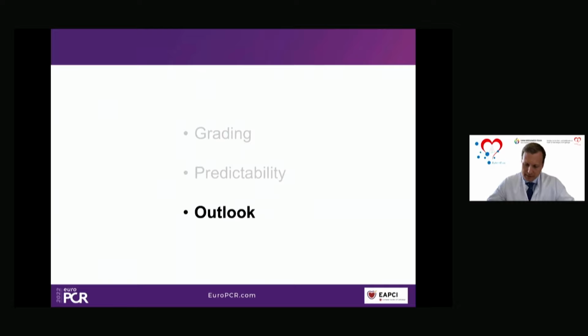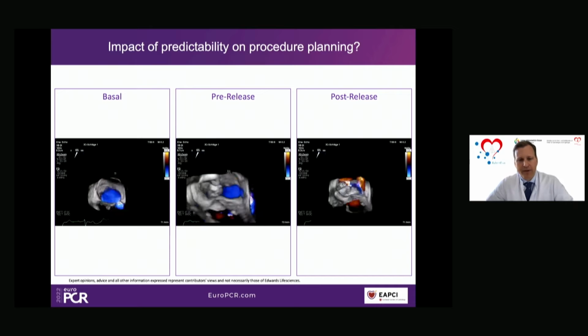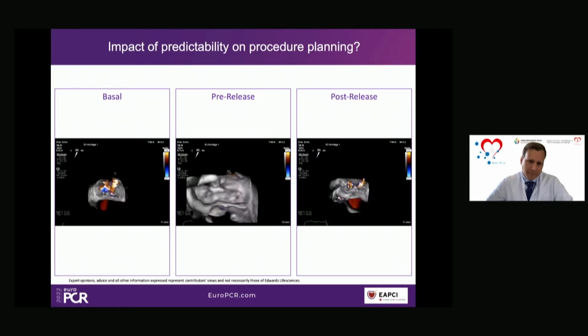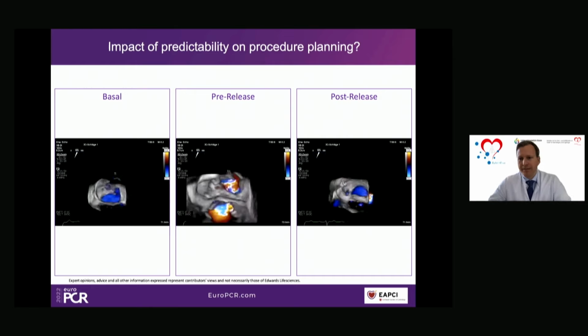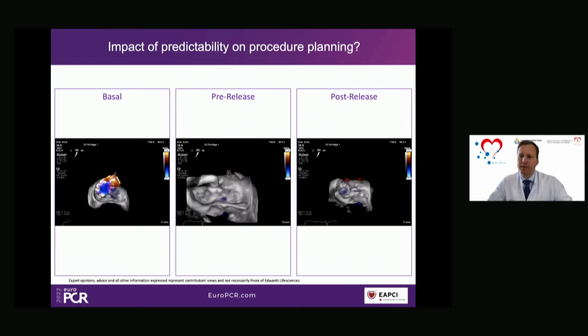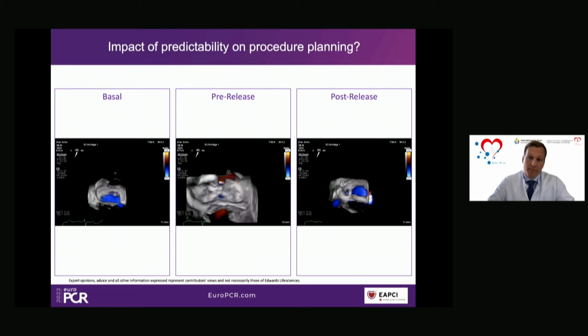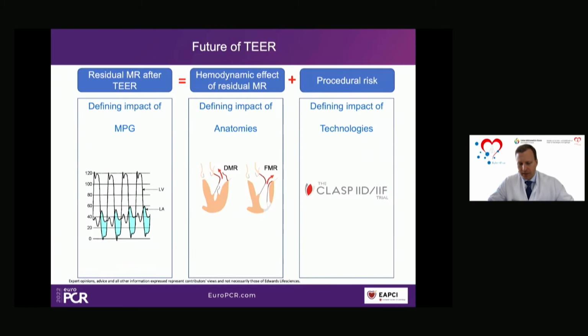important in sessions like today, that we should reach out to identify those patients, like this old lady whose loops I presented earlier, where we have a dramatic MR before, we have an acceptable reduction while the device is at the steering catheter, and when we release the device, then you can see there is a massive deterioration of the residual MR. In this particular case, it was a very old patient. The gradient was very high. The anatomy was not suitable for a second device. And so she ended up with this result, which is not acceptable at all. So this is something we need to learn from.